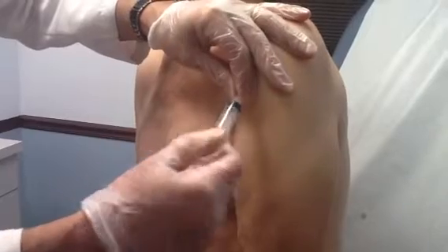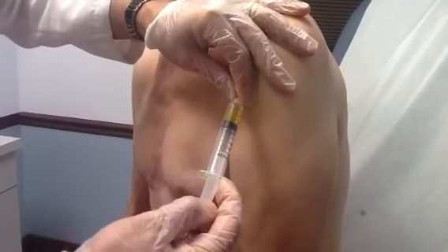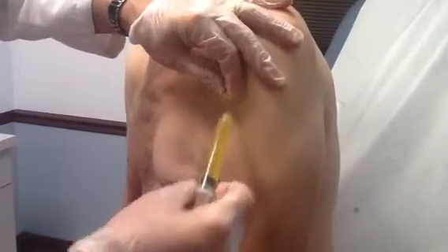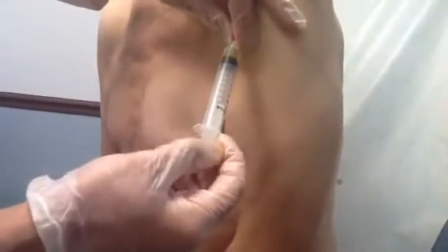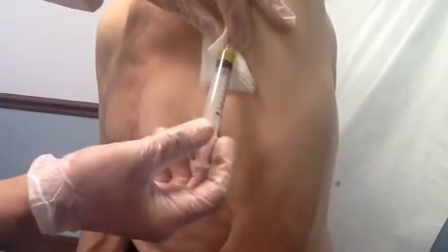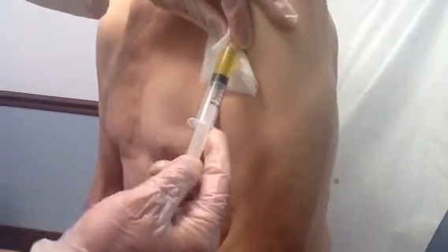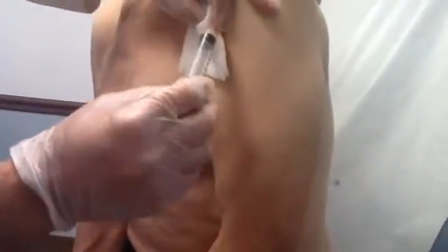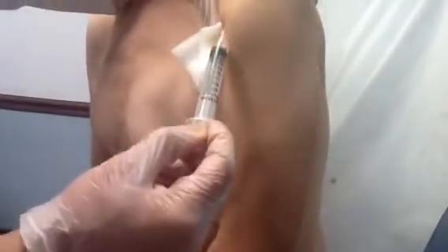The fluid is completely dark yellow. We're going to take one more. We see a lot of protein in the center. If this were bloody or any different color, I would be concerned. You can see the protein part — this is a type of protein.